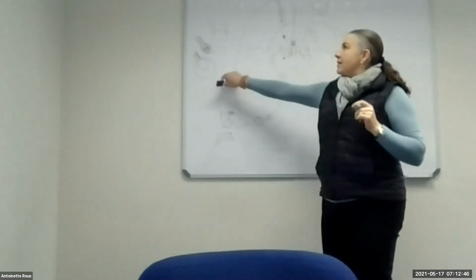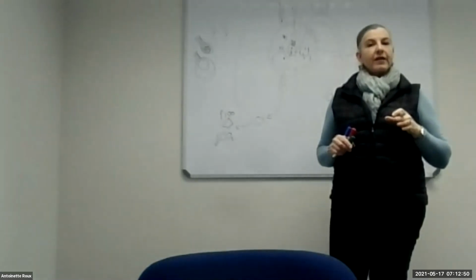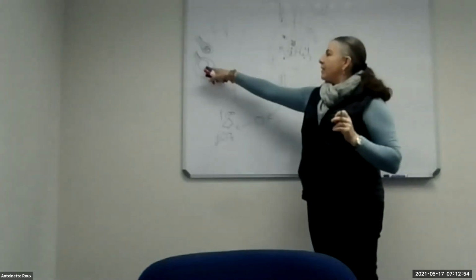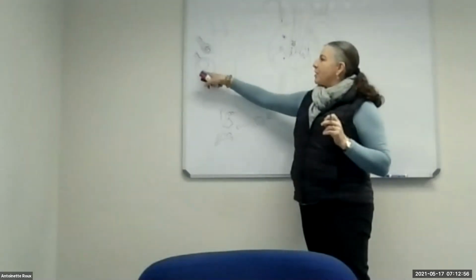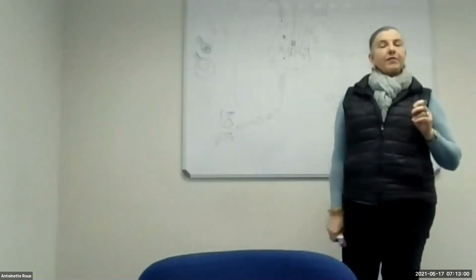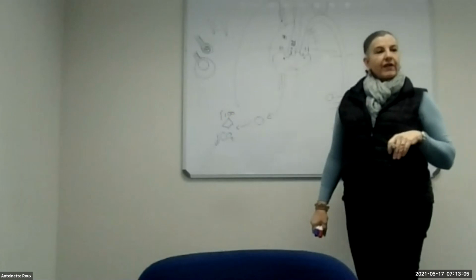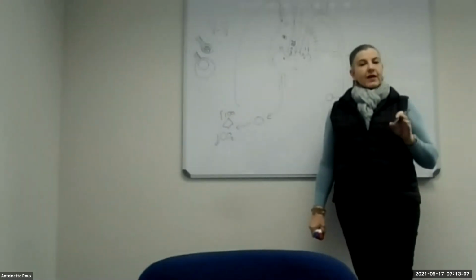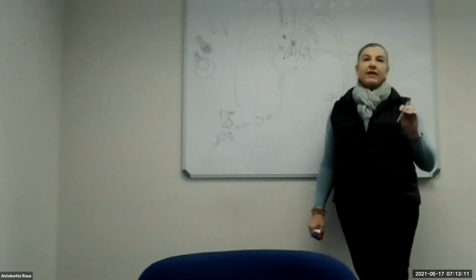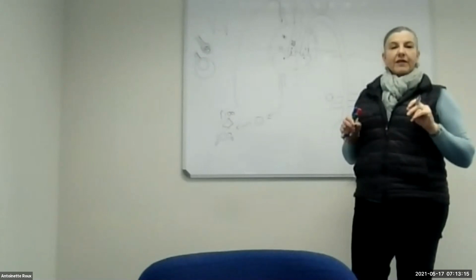So on your blood gas, there's one reading that you have to look at. You have to look at your A-a DPO2. A-a DPO2 is your A-a gradient. It measures the pressure from the inside of the alveoli to the capillary. So normal A-a DPO2 is supposed to be 5 to 10. And you will see that in any ventilated patients, A-a DPO2 will be around about 100 or something like that. When you go to ECMO, we sometimes start off with a 600 A-a DPO2.